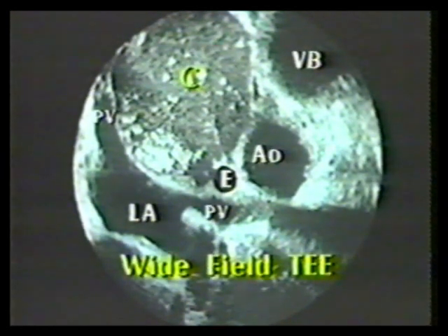To better elucidate this cystic structure, a prototype wide-field transesophageal echocardiographic examination was performed. This is a 360-degree scan highlighting the descending thoracic aorta, vertebral body, and large cystic mass. Note that the mass appears as an ovoid structure. It compresses the upper pulmonary veins and distorts them slightly and produces minimal compromise on the left atrial cavity. This new imaging modality is a most intriguing application of esophageal echo.